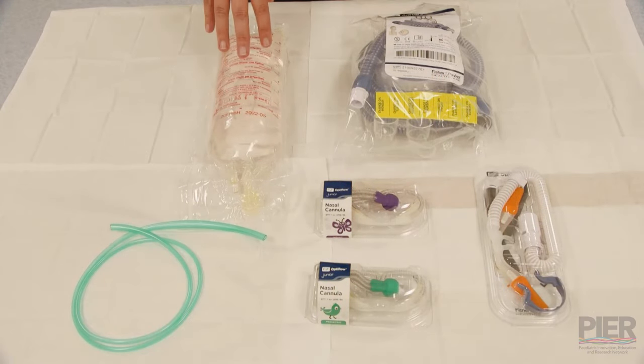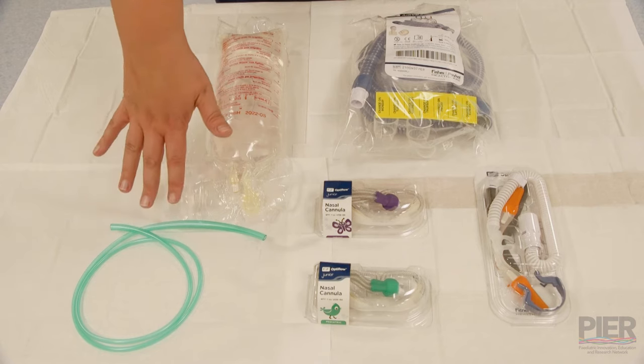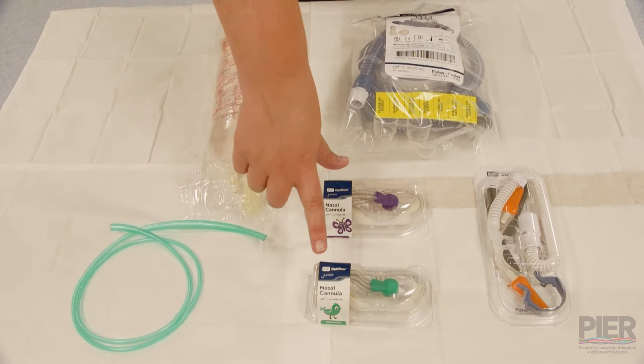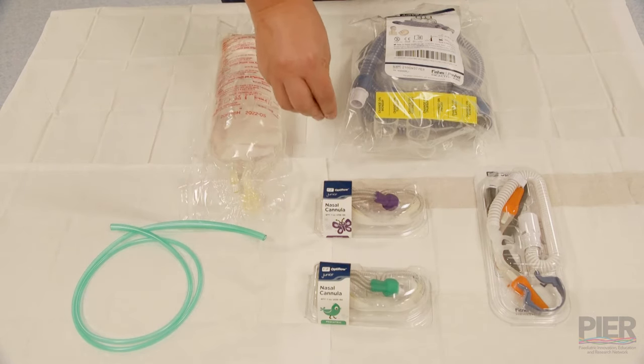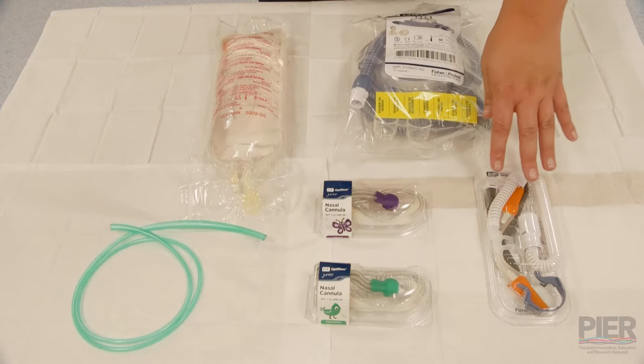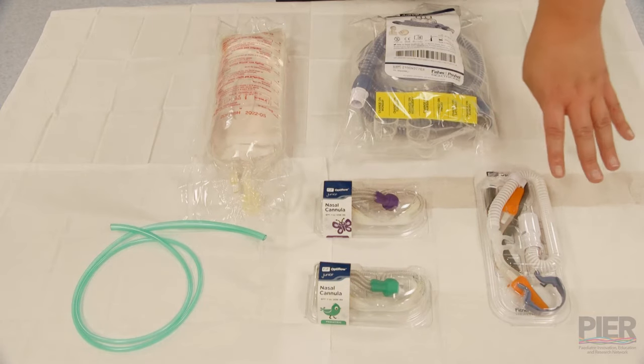We've got the Airvo circuit, the water for humidification, some green oxygen tubing, two sets of junior prongs, bearing in mind that the yellow prongs aren't suitable for use on Airvo, and then there are adult prongs. These come in small, medium and large.